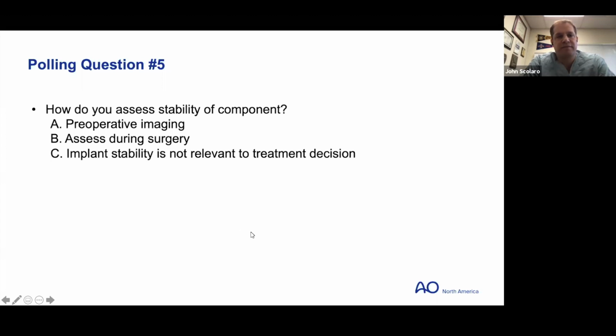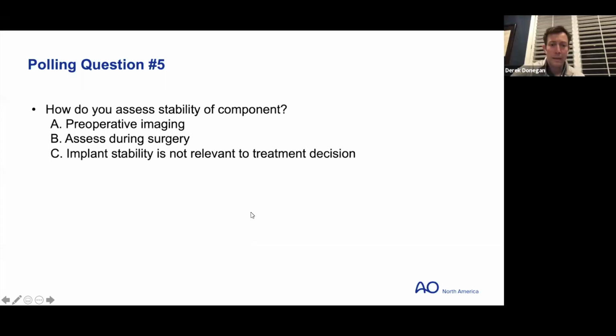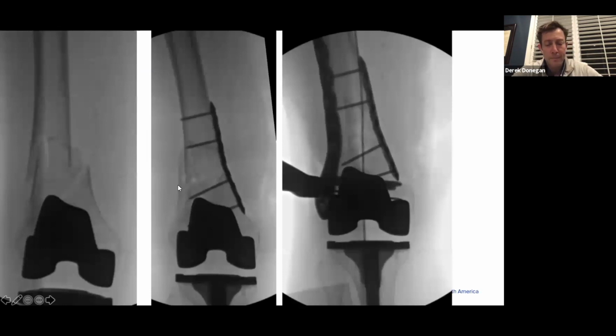Yeah, I think you bring up a lot of good points, and it sounds like some people aren't looking at it at all, and some people are doing similar things, either intraoperatively or preoperatively. So it's kind of across the board. But I think it depends on if you're going to do anything to it or not, right? And I think Bill Ritchie's study looked at this and showed that less than 1% of these are loose, right? That there's decent bone to get fixation.